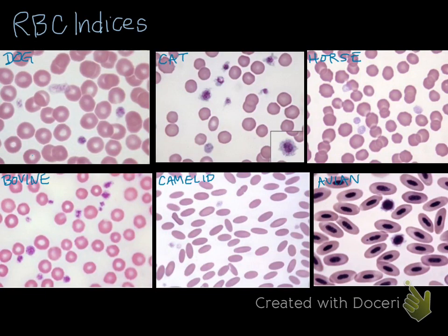Before we talk about red cell indices specifically, we're going to talk a little bit about the different appearance of red cells in our various veterinary species. And just to realize that red cell indices, when we talk about them, we're really going to be talking about size or volume of red cells, as well as hemoglobin content. And so we also assess not just these indices, but how the red cells actually look. So that's why I'm going to kind of go through this.